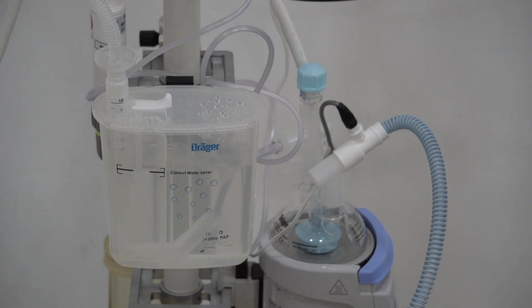And I know that not every hospital would have access to active humidification. However, I think it's important to emphasize the importance of delivering humidified, saturated, warm air, in order to avoid damage to the trachea and also to the mucociliary system of the baby.